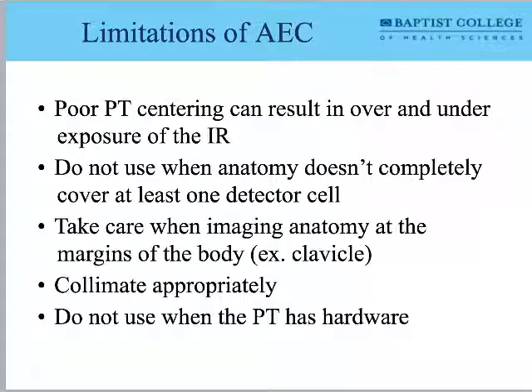It is too light. It is too bright of an image. So is it overexposed or underexposed? Underexposed. Good. So what this means in the world of the AEC is it cut off too soon. It cut off before it had adequate penetration. We didn't get enough exposure, enough density in the anatomy of interest. That's what a picture looks like, on film at least, if it cuts off too soon.